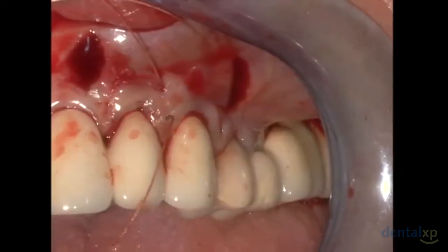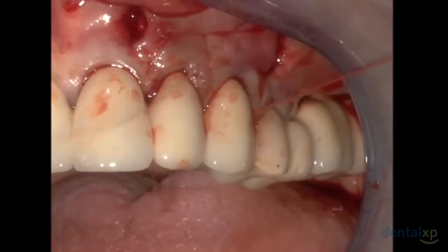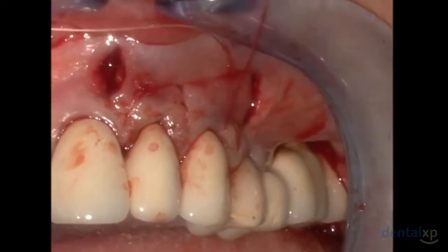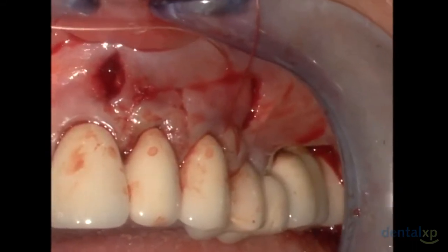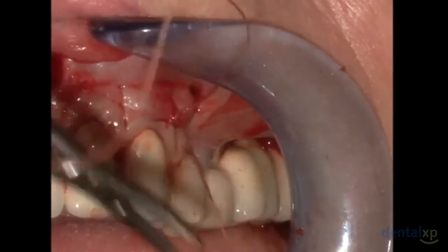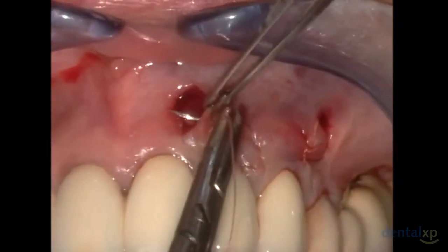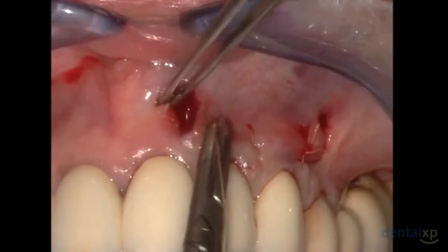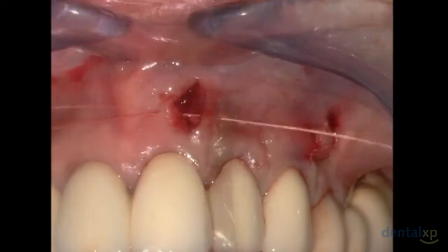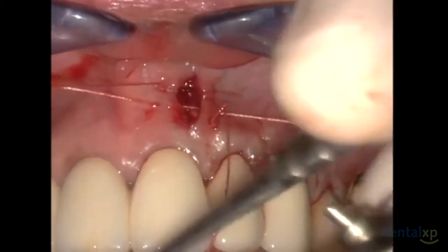And this is something that I go over in great detail during my soft tissue hands-on course here in Atlanta and around the world. You can see as I start now to secure the second suture, as I start to pull on the suture, it compresses and vertically extends the flap and the Perioderm over the exposed or previously exposed root surfaces. Only at that time do I close my vertical incisions, again utilizing a 5/0 or 6/0 Vicryl or nylon suture as my preference.